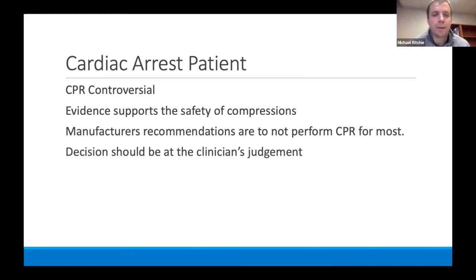Have I done CPR on people with a VAD? Absolutely. Temporarily, kind of as things go. Usually, because they have continuous flow, they get return of circulation easier than people that don't have continuous flow with the VAD. So we've done it for a temporary amount of time just to ensure that you're having some flow, because you're really supporting almost the RV whenever you're doing it, to get that blood to the LV so that the VAD can continue to work.